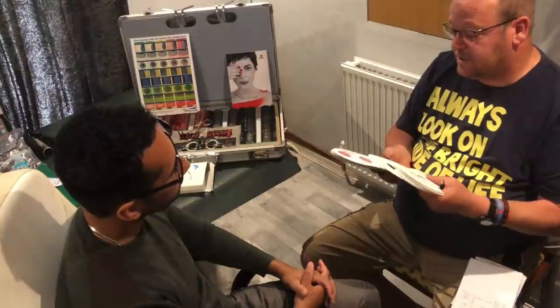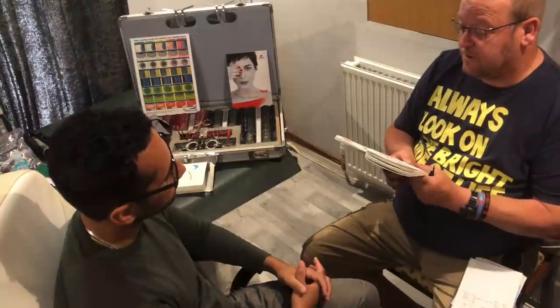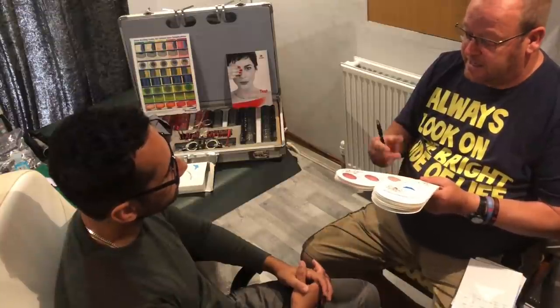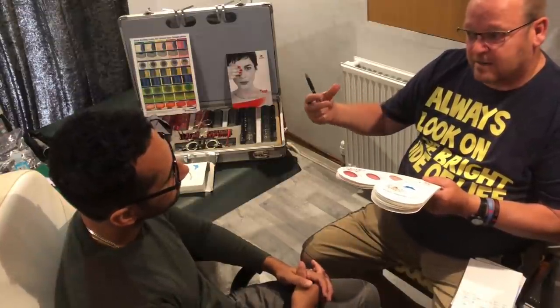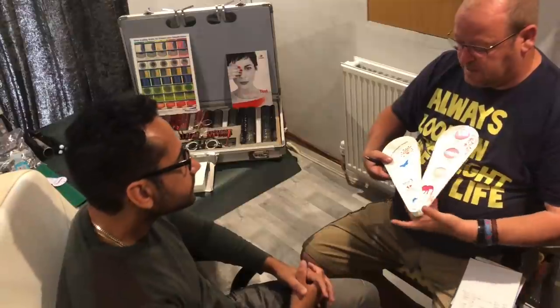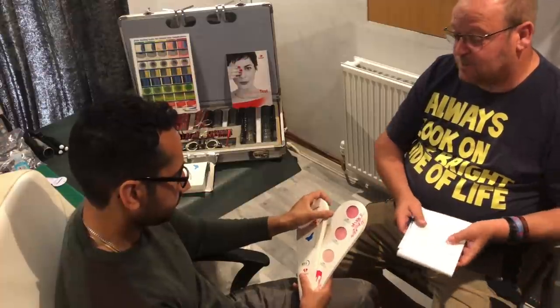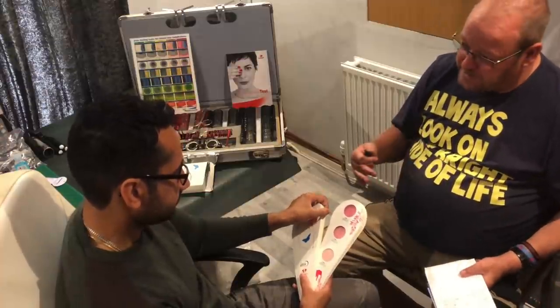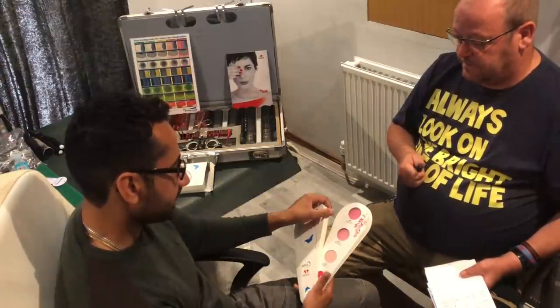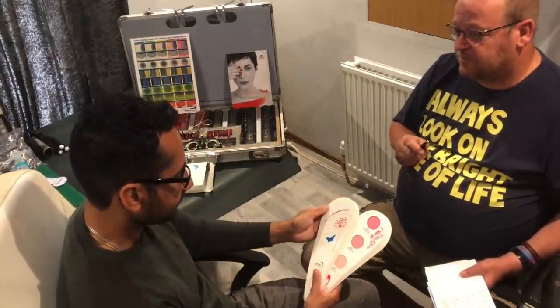We're starting to come up to some specialist tints. This particular tint is called India, and it's more of a rose-coloured tint. You've heard the term 'seeing through rose-coloured lenses.' Instead of taking away light, this adds light but takes away the glare at the same time. So it's not necessarily the favourite colour to walk around with for what people see — this is more a case of what you see. So we get increased light but reduced glare. But it still follows the same rules and regulations when driving.